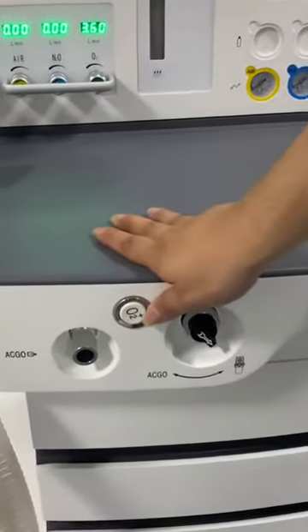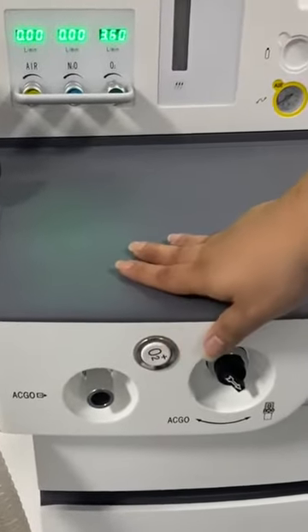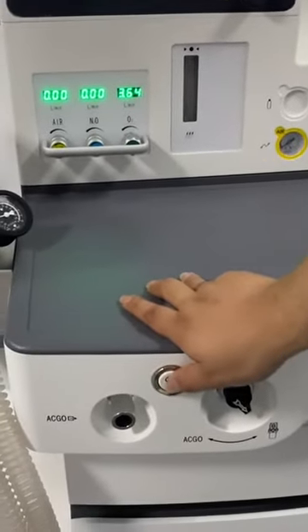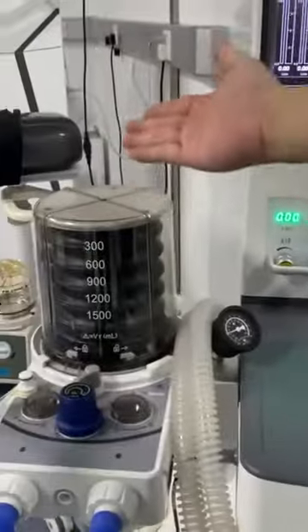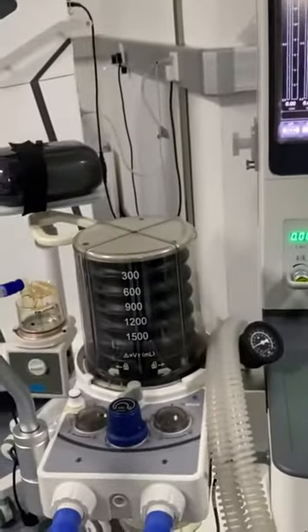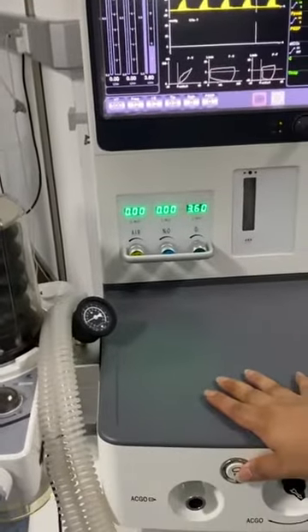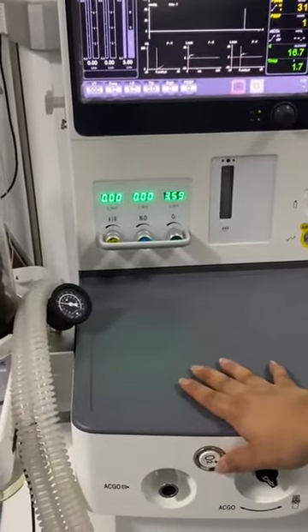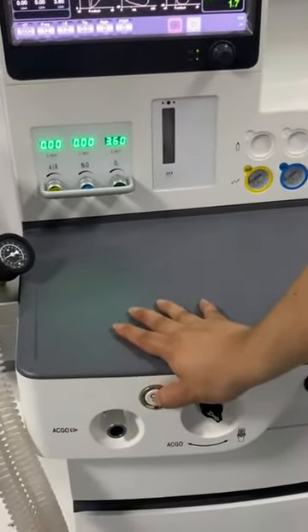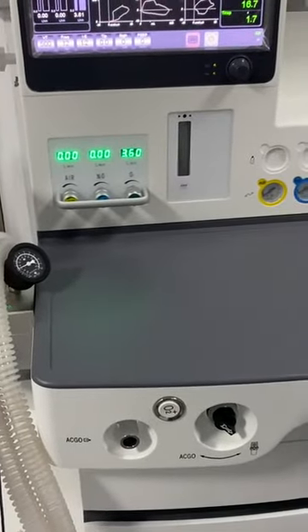And this button is the rapid oxygen supply. For the rapid oxygen supply, there are 2 functions. The first function is that before the operation, we can press the rapid oxygen supply to make the bag go up to the top side, and then the operation can be started. And the second one is that once we see from the patient monitor that the patient's SpO2 has any problem, we can also press the rapid oxygen supply to give pure oxygen to make sure the patient recovers from the SpO2.